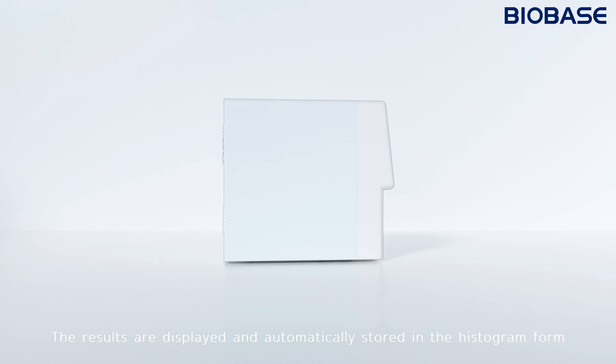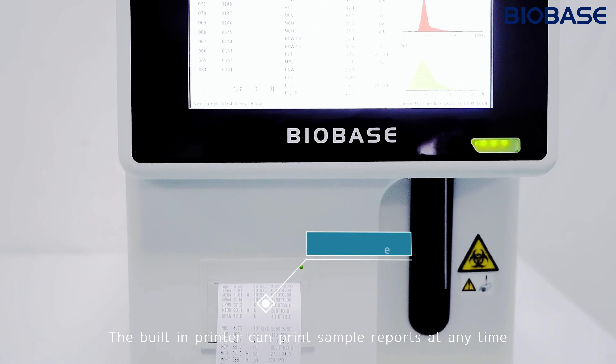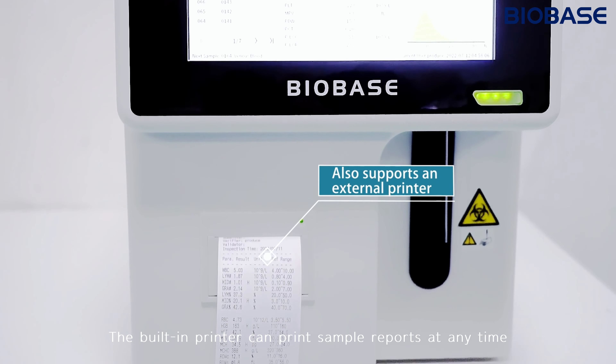The results are displayed and automatically stored in histogram form. The built-in printer can print sample reports at any time.